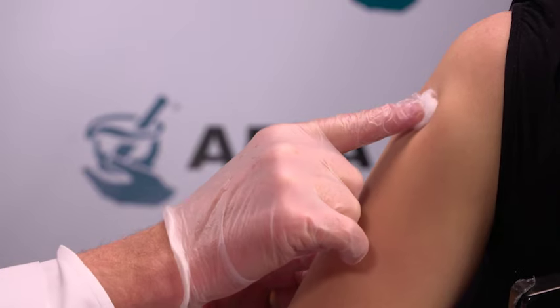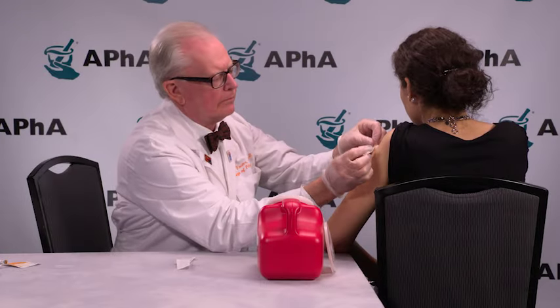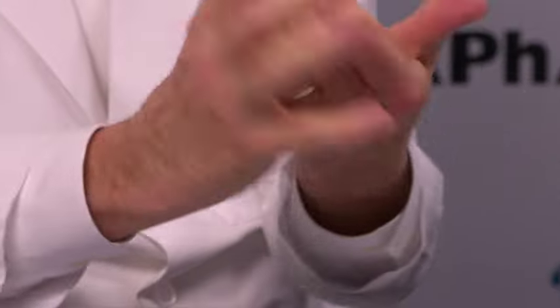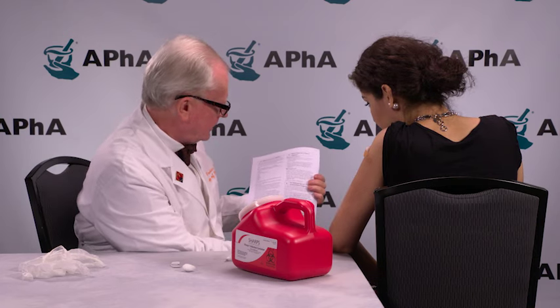Press the cotton or gauze over the injection site and secure this to the patient using the adhesive bandage. Remove your gloves and wash your hands. Change your gloves between patients. Provide your patient with post-injection counseling and follow-up instructions. Document the injection given while maintaining compliance with all legal requirements.